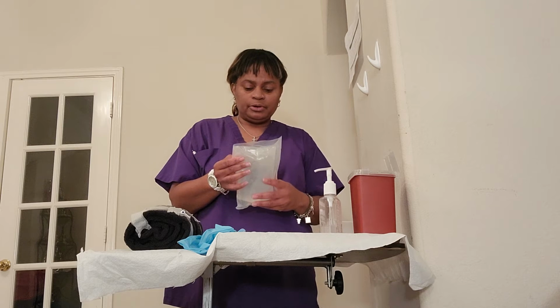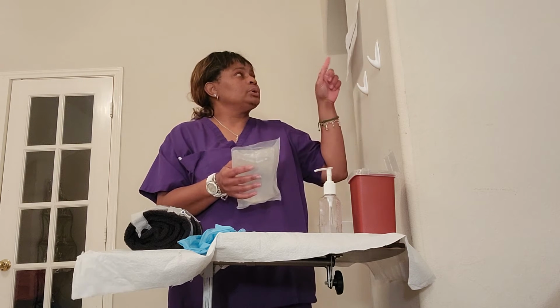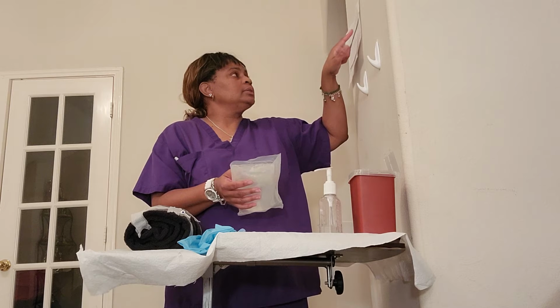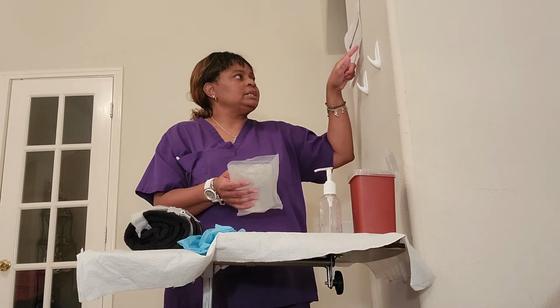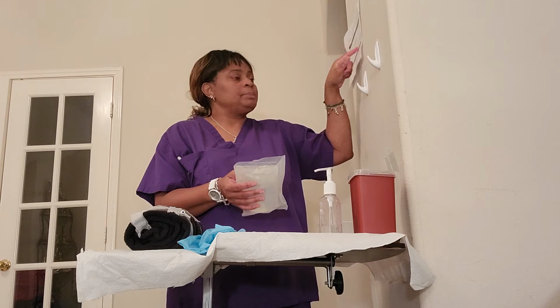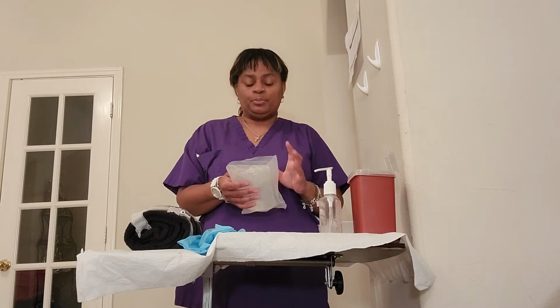So I'm going to do my third check now, and this is for Miss Millie Larson, date of birth 1/1/1936. 123456 is her MRN, no known allergies. We are doing the 500 mLs of normal saline at 125 mLs per hour. The drop factor here is 10 drops per ml. It will be 21 drops per minute.